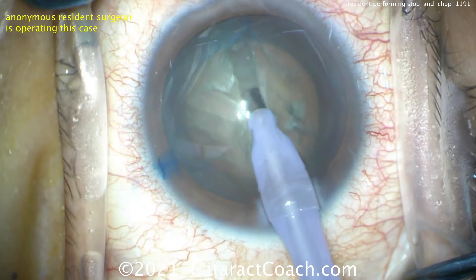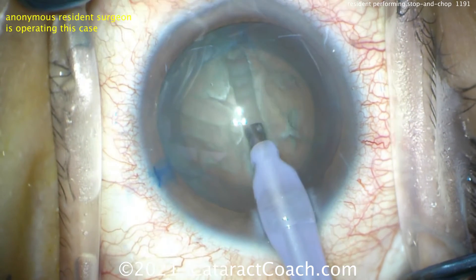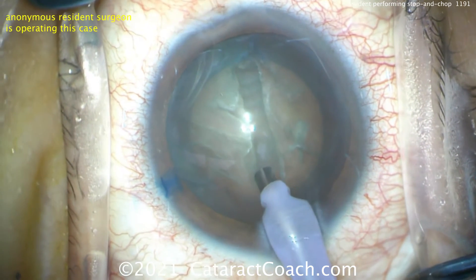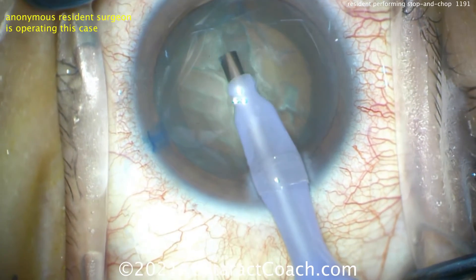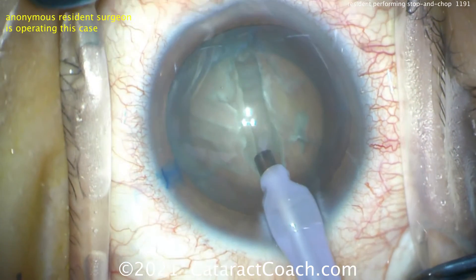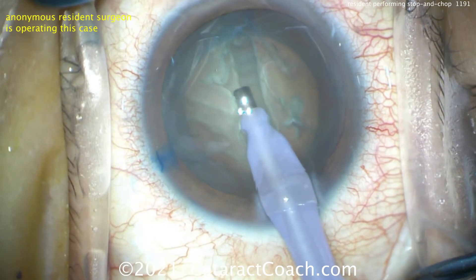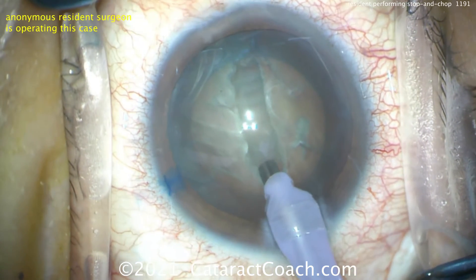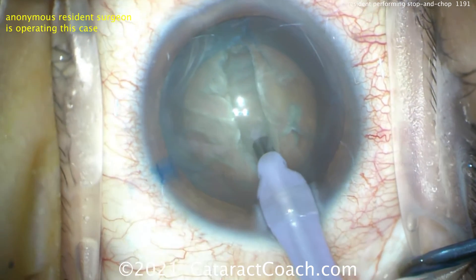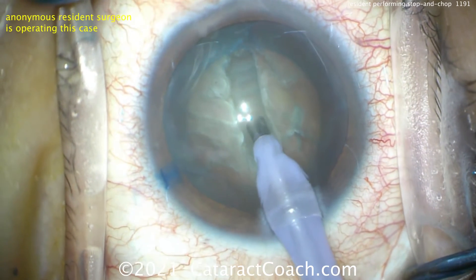The nucleus is being sculpted nicely, but the sleeve of the phaco tip is hitting the side — so it's time to widen up the incision. Notice how the eye stays in primary. Those Purkinje images stay right in the center because the resident is moving his hands to keep the eye in primary. Pivot your hands in that incision. The groove is deeper in the center and a little shallower toward the periphery, with nice long grooves.